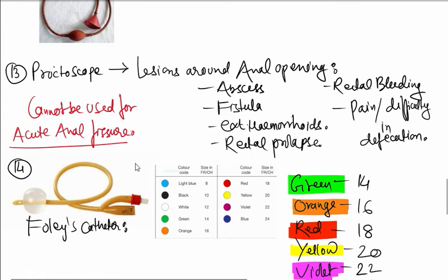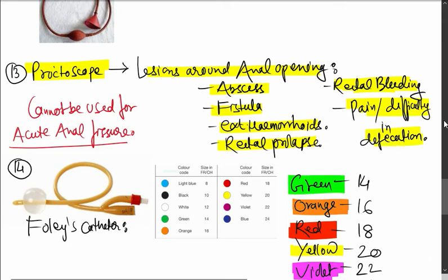Next one is the proctoscope. It is used for lesions around anal opening like abscess, fistula, external hemorrhoid, rectal prolapse, rectal bleeding, pain, difficulty in defecation. But it cannot be used in acute anal fissure.